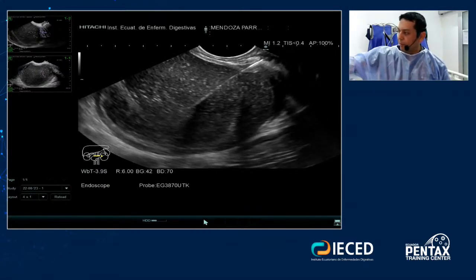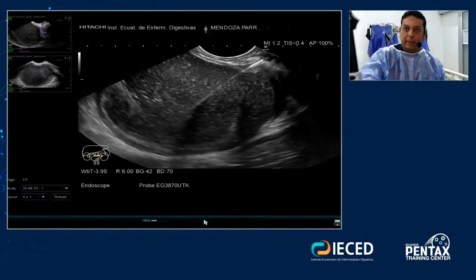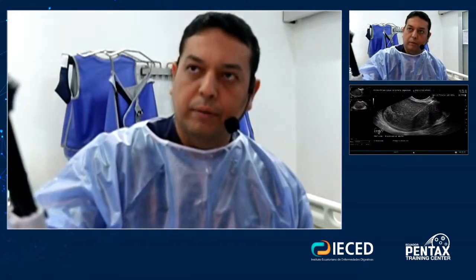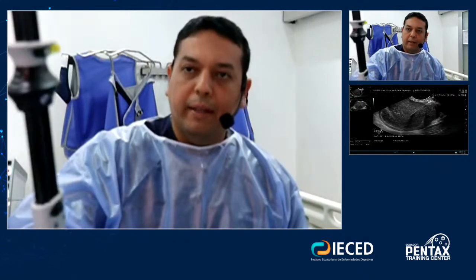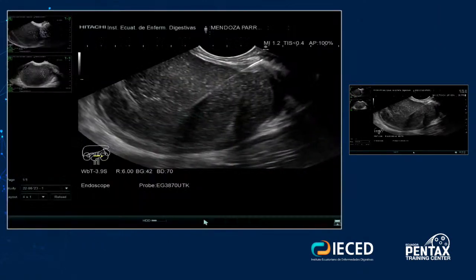So for a moment, let me handle this. So you can see the steps here. So we have step number 1 going down, step number 2 open up, then step number 3 going up again, and then step number 4. Step number 1 is just for going inside.